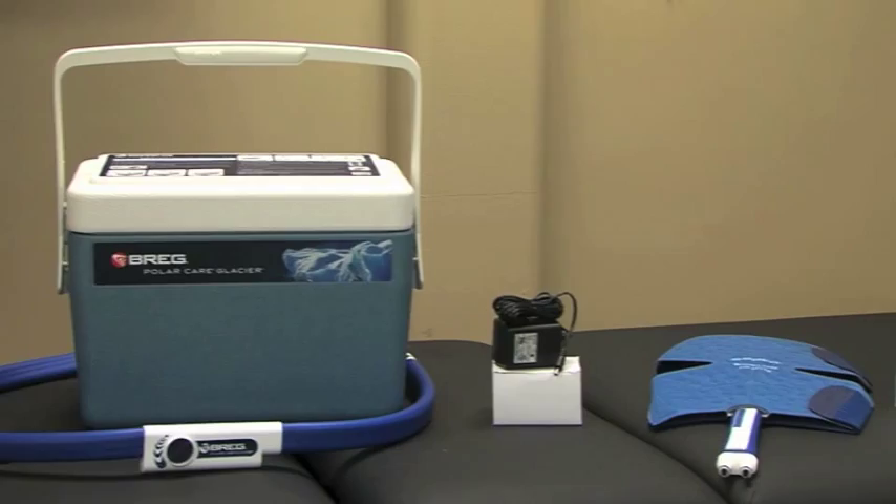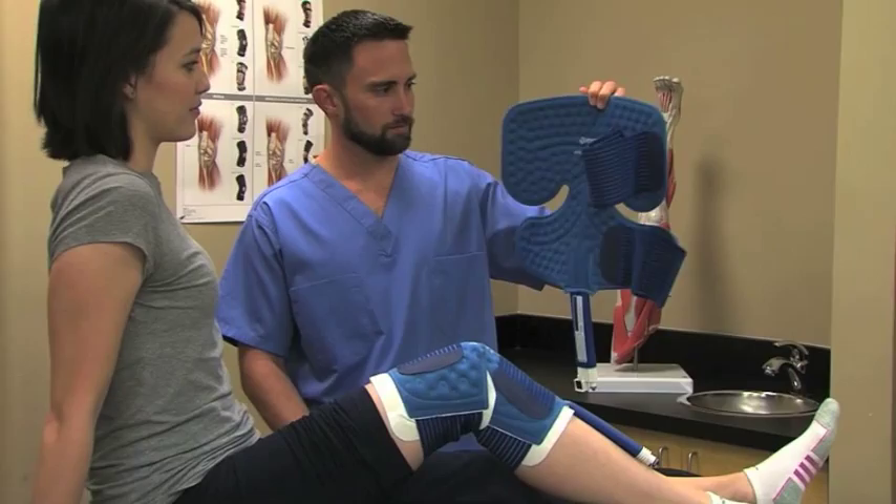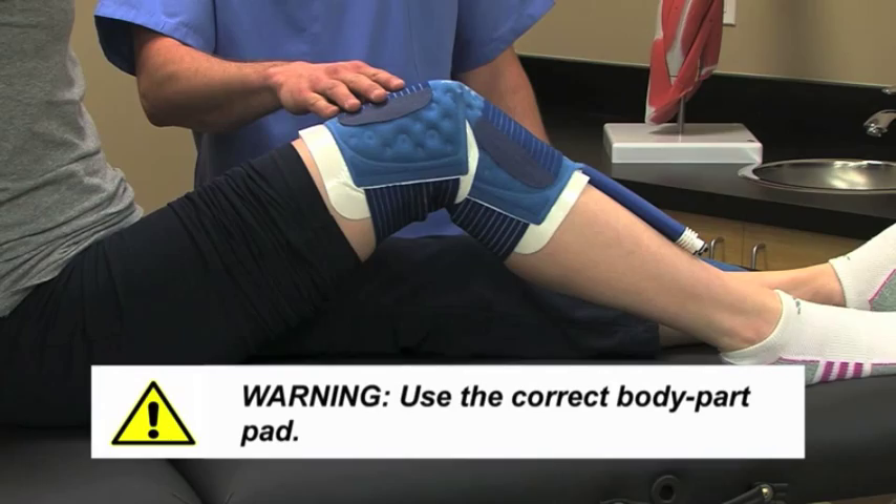The PolarCare Glacier consists of four parts: the unit, the power supply, the pad, and the insulation barrier. PolarCare units come with body part-specific pads. This one is a multi-use pad, which can be used on various core body parts, while this one is for the knee. For patient safety, it is essential to use the pad designed specifically for the body part being treated.